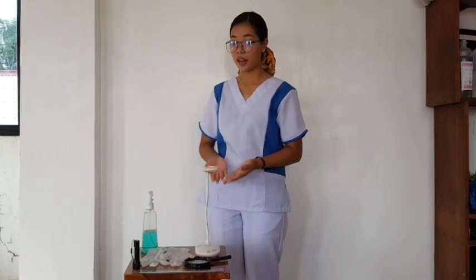But before I start with that, let me show you the equipment that we'll be needing in assessing the hair, skin, and nails. So first, we have here gloves. Next, we have to use a pen light or alternative flashlight. Then, an exam light or wood lamp. If available, go to a place that is bright. And next is a magnifying glass, and last, the centimeter ruler. So here I already give you the complete materials or equipment that we are going to use later. So let's get started. And now I'll be assessing the patient.